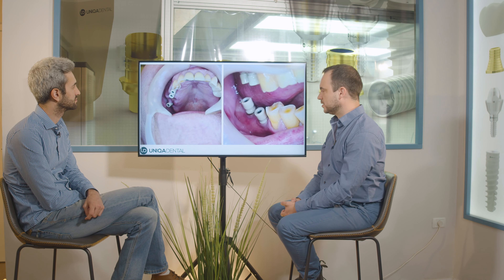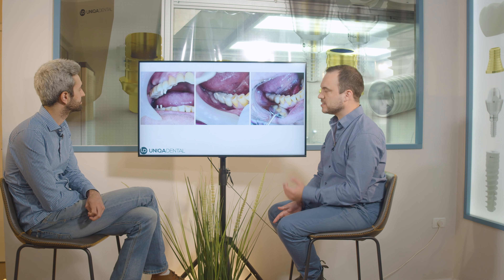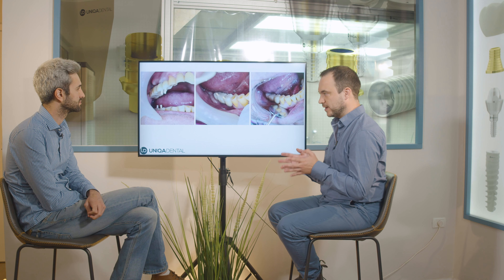This is the temporary bridge, because we just extracted the tooth and we want to let the gingiva heal a little bit. We want good healing of the gingiva, an emergence profile from the gingiva, and an indentation in the gingiva for the tooth. At this step it's not ideal to make a permanent restoration.